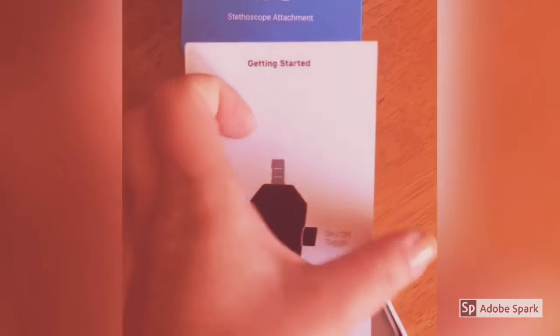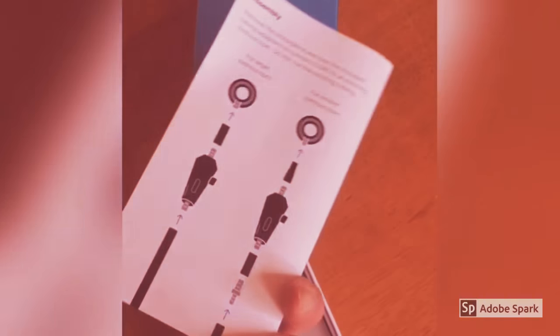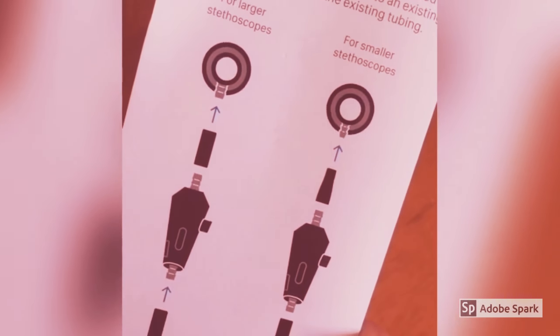First we've got this little very simple instruction manual here. Seems easy enough — even I can follow this. Yeah, we've got some images here. This is perfect.